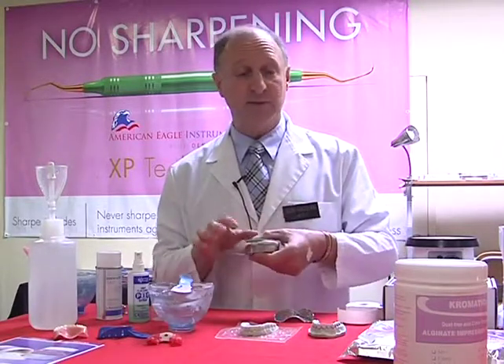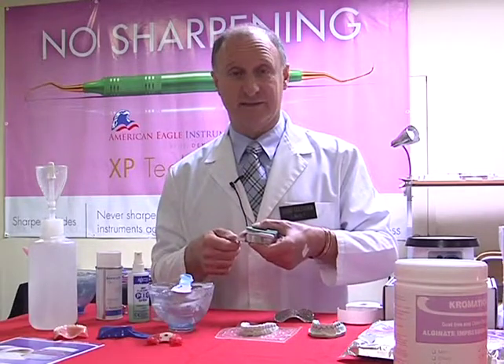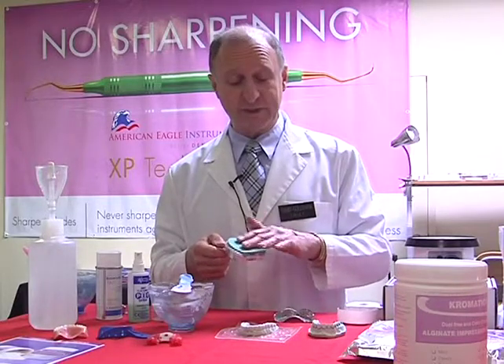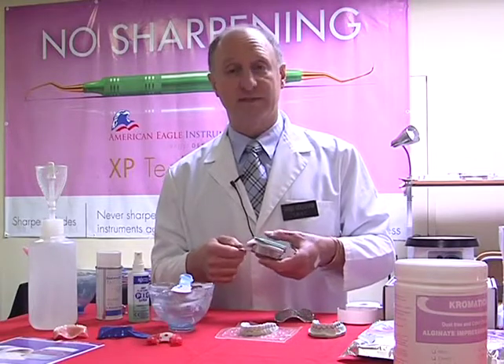When it's white, we know the material's set, and that's normally within 60 seconds with the most alginates. But in this case, with this material, I've still got the same working ability, but it's only 20 seconds, so it's much faster, kinder to the patient. After the 20 seconds, we'll see the material again starting to turn white. We know the material's set.